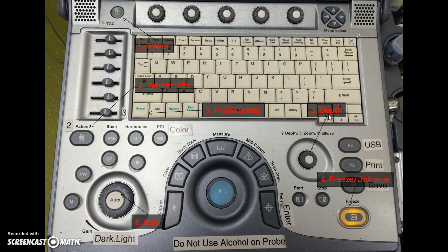Next is depth, and this is really important in terms of optimizing your image. And so for learners, you can control depth in multiple different ways, but the easiest is to use this bar right here, or this toggle, like a wheel. What it does is it allows you to make your image look deeper or less deep, depending on what you're looking for. If you're looking to place an IV, you certainly don't need as much depth on your probe, but if you're looking at the kidneys, optimizing that image might mean adding more depth.